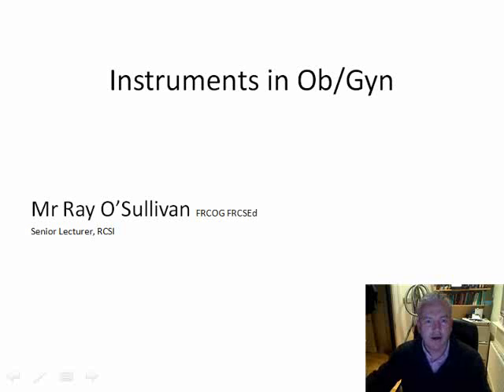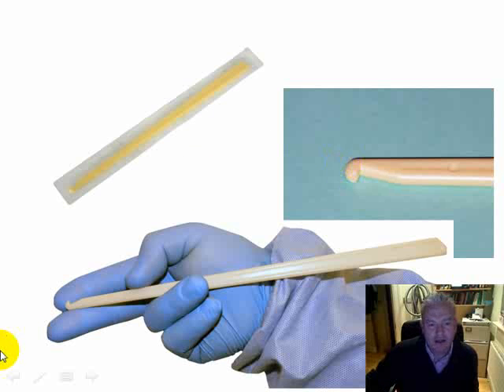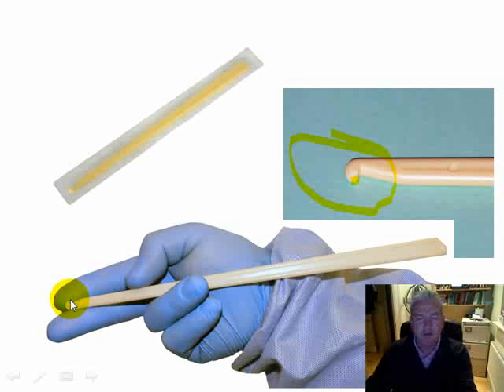Now, we said we'd give you a talk on some instruments that you might come across during your OBGYN rotation. One of the first things that you may be shown is an amnihook. The amnihook is generally a long plastic instrument that's inserted along the fingers. And at the very tip, as you can see here, there's a small little hangnail or a little crochet type hook that will snag the amniotic membranes for artificial rupture.